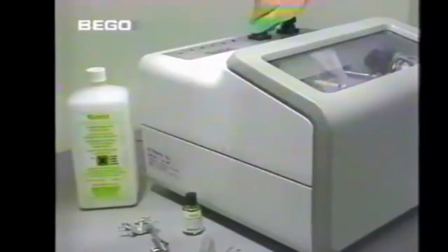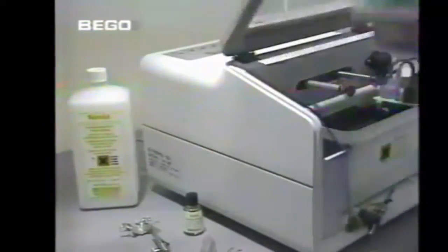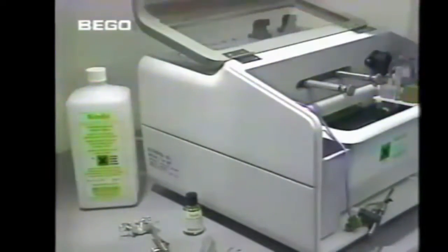When stippled surfaces, such as this base, are finished with a blunt carbide rose drill, electrolytic polishing is more effective. Blasting with fine aluminium oxide and Perlablast before polishing improves the surface finish on the insides of the clasps and rests and enhances the final polish.